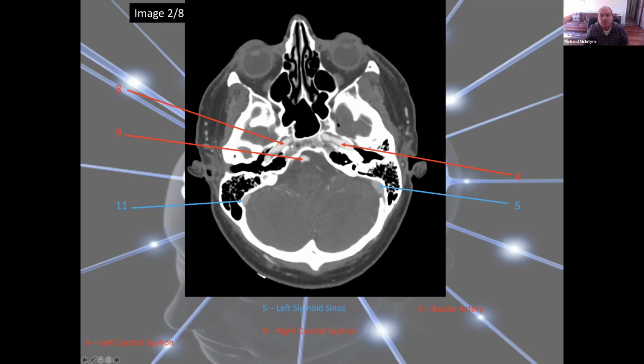Yes, the opacity of the vessel does help to determine whether it's a vein or an artery. That's really good. It's usually a lot more dense in the artery because the contrast is going up through the arteries and then gets a little bit more diluted before it goes to the veins. So that's a really good point.